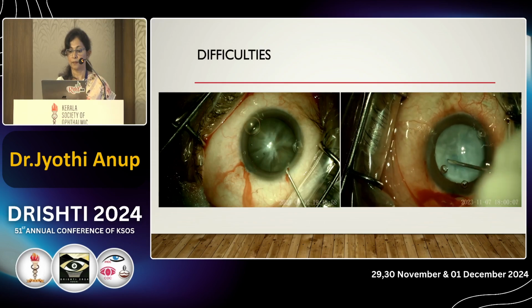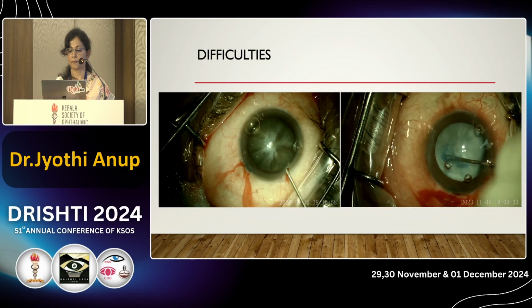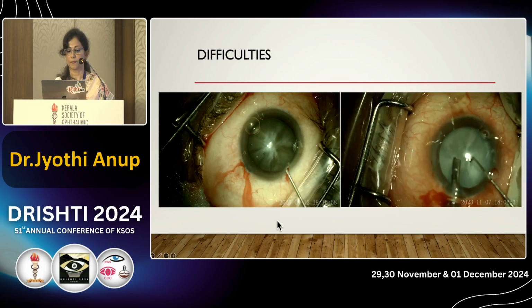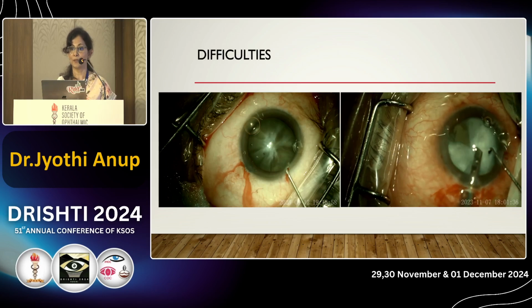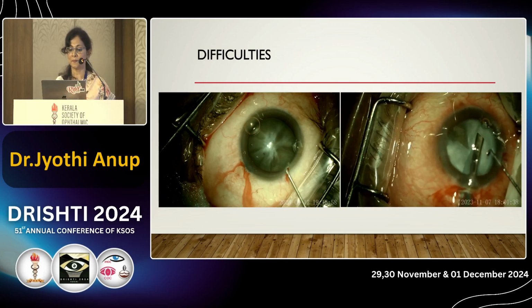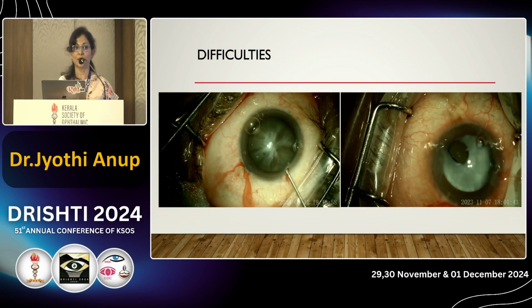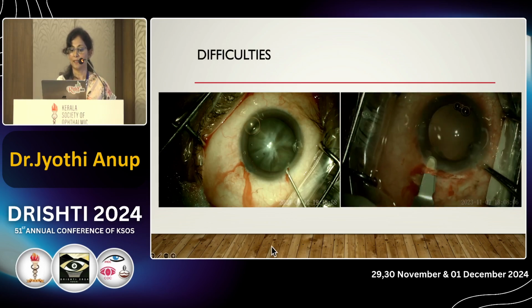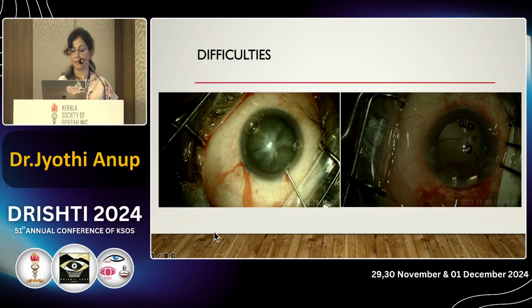And the rhexis was uneventful. And whenever you see a clear area in the phaco, you should always suspect a PCR. And this is not vitreous, this is silicone oil which is coming up. There was a large PC dehiscence. The conversion was very smooth.